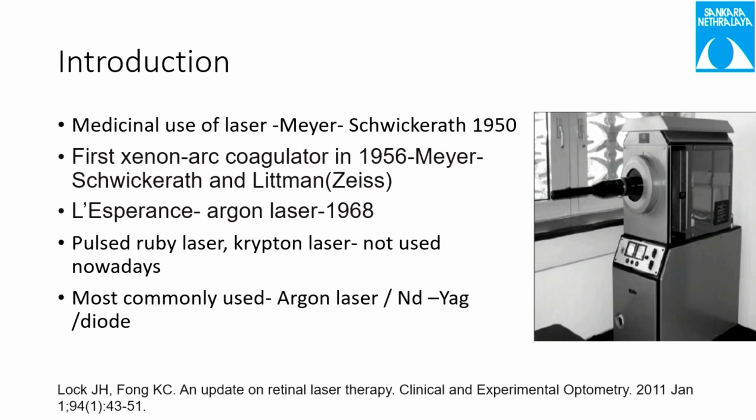Moving on to the introduction, the medicinal use of laser was discovered by Meyer-Schwickerath in the year 1950. The first xenon arc coagulator was introduced by Meyer-Schwickerath and Littmann in the year 1956. It was in combination with Zeiss. Esperance, in the year 1968, introduced the argon laser.